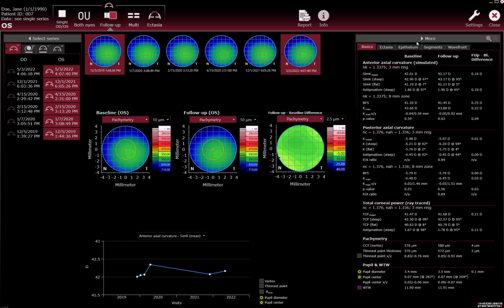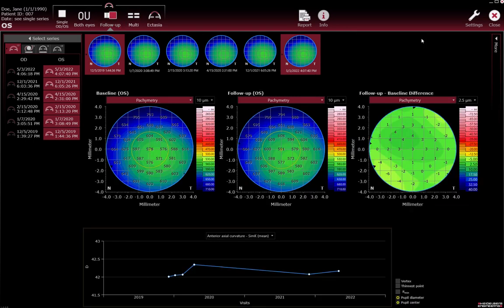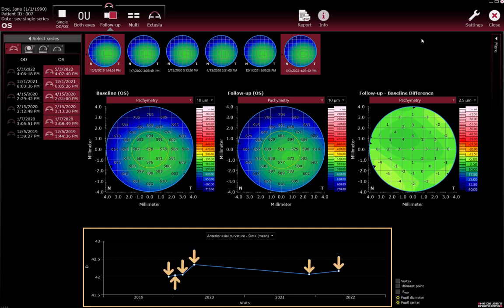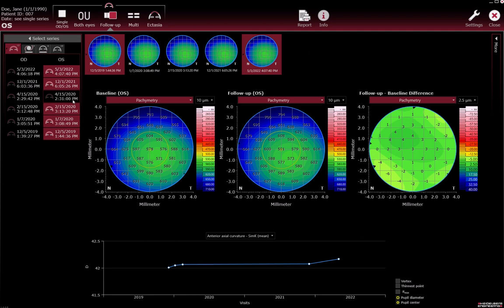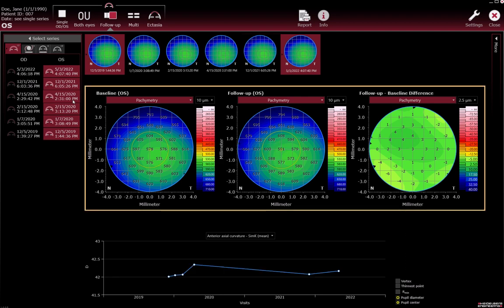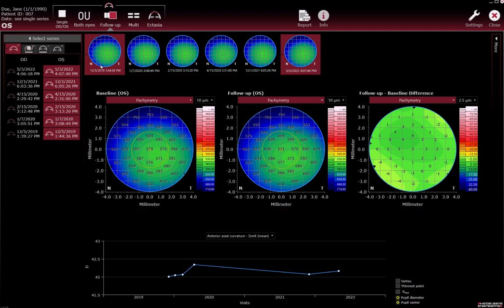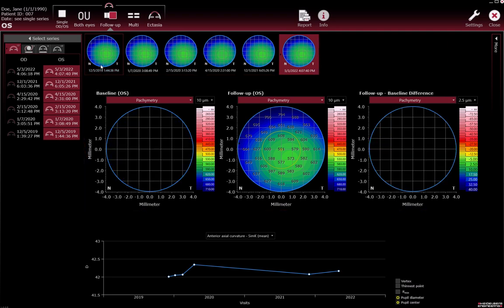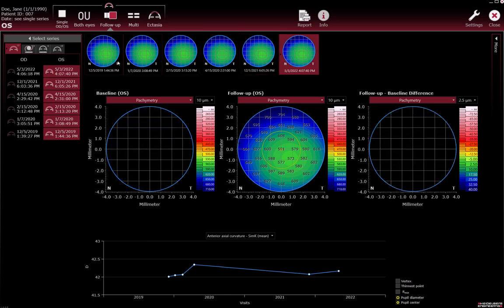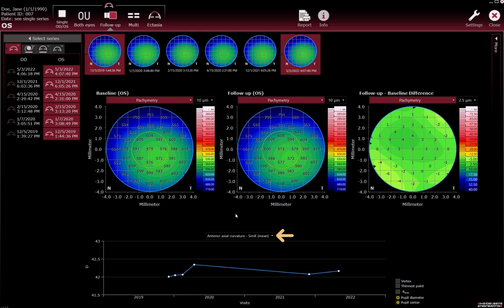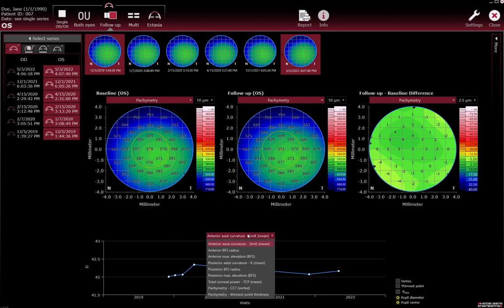Minimise the More tab to have a closer look at the maps. A trend analysis graph is available for three or more selected series performed on different days. To exclude series from the analysis, click the entry in the Select Series section. Click the entries of the desired series to be included in the trend analysis. To change the baseline series for the difference map and More section, click the thumbnail of the baseline series and then click the thumbnail desired to be the baseline.